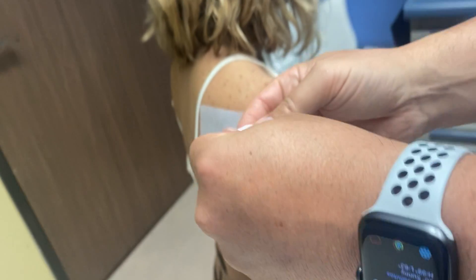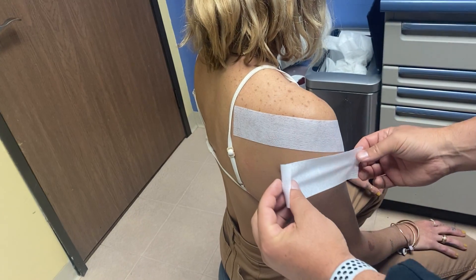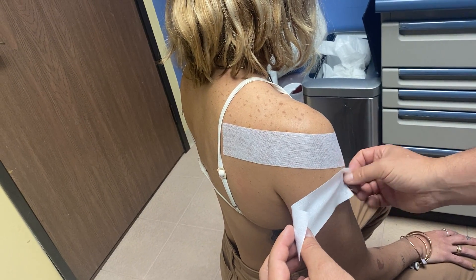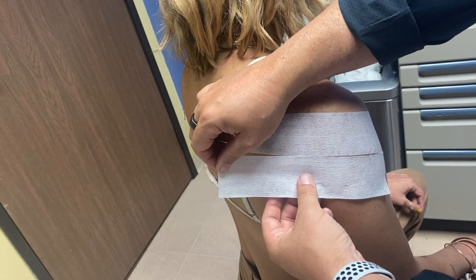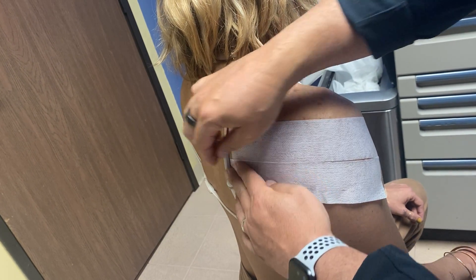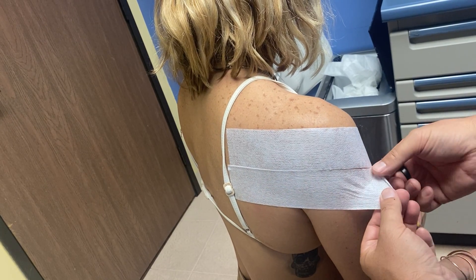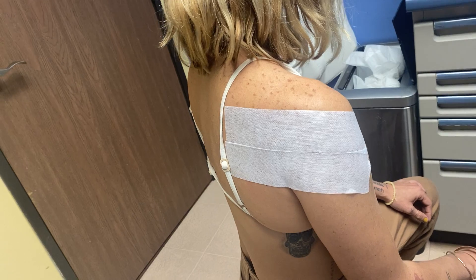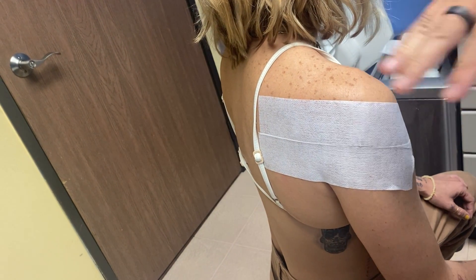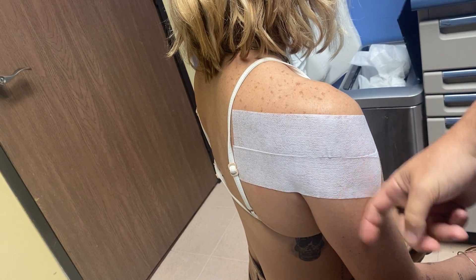I want to take that tape off so it's not going to stick to itself. This tape likes to stick to itself, so we're careful to avoid that. No real stretch on this at this point. I'm going to make sure there's no gap between the two. Because the shoulder has a tendency to come out of place — meaning the shoulder is partially dislocating or subluxating — we're going to tape the shoulder back in place, and this is very effective.